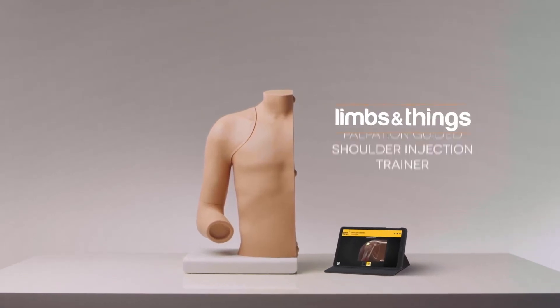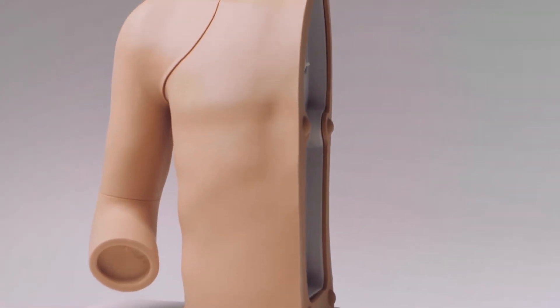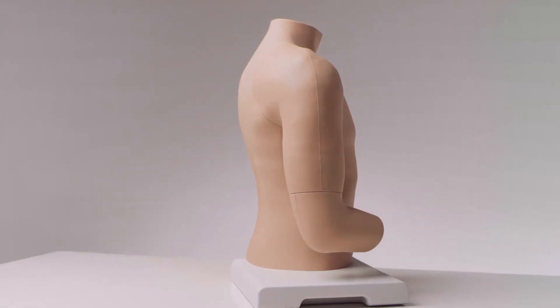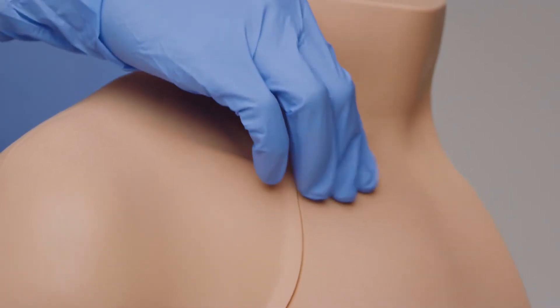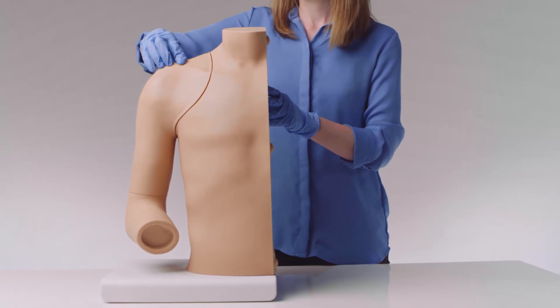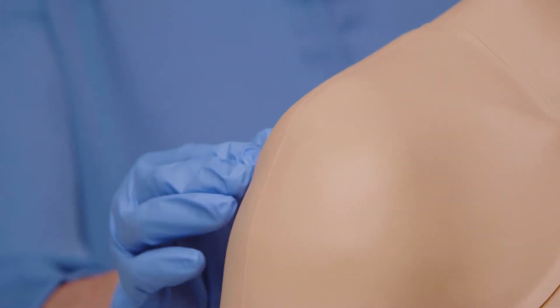This is the Limbs and Things Palpation-Guided Shoulder Injection Trainer with Companion App. It is an anatomically correct adult right shoulder that provides a realistic teaching and training platform. Suitable for postgraduate learning, the shoulder features all the relevant landmarks and underlying structures, including discrete muscle and skin layers.